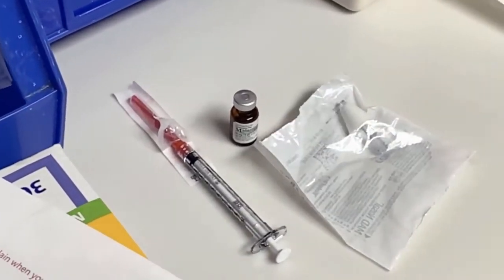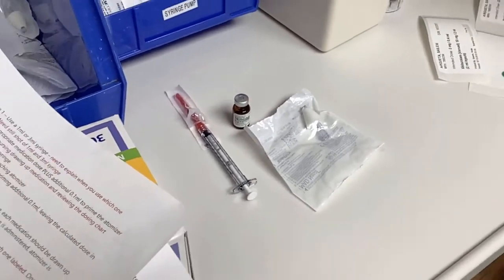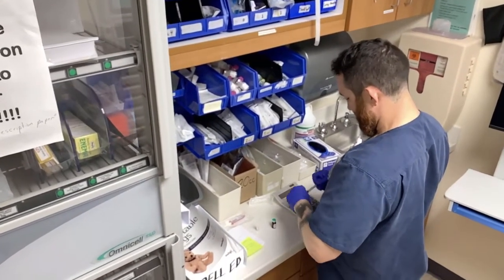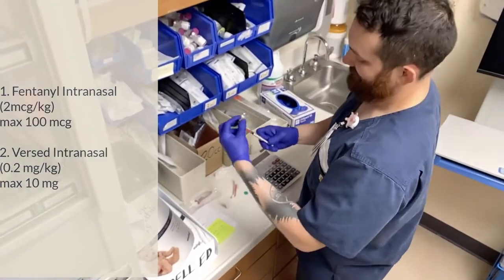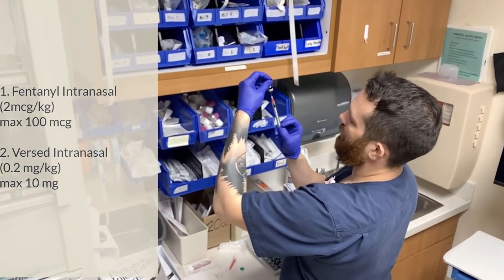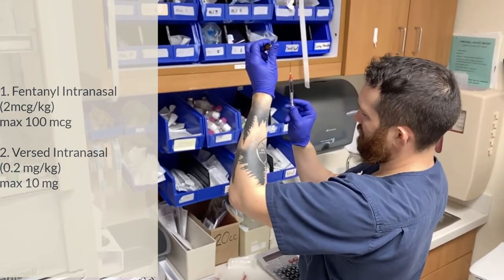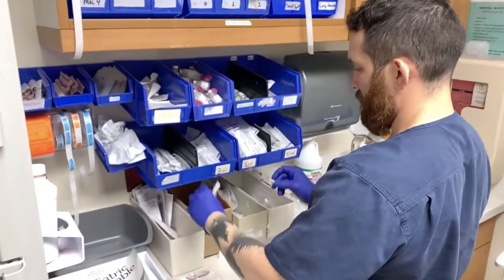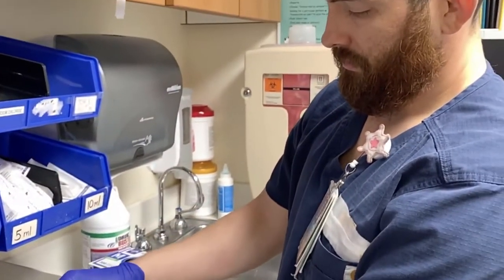So again, here are the materials to be used. You have the syringe, the nasal atomizer, and the medication. So again, if being drawn from a glass ampule, we may need a filter needle, and some of the correct doses per medication are indicated on the left for fentanyl and midazolam intranasal. And again, always remember that there is a strict 1 milliliter limit per nare, and if indeed it exceeds 2 milliliters, we have to wait for 30 minutes before the completion of the medication administration.